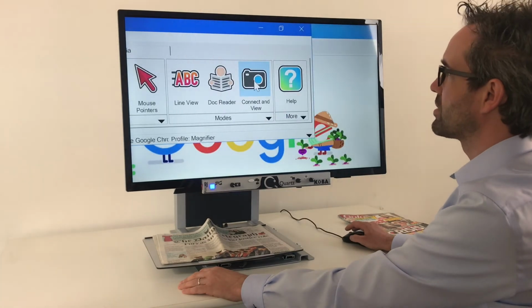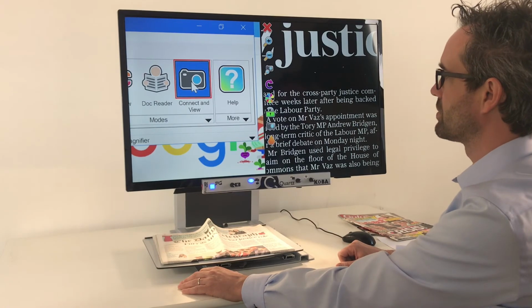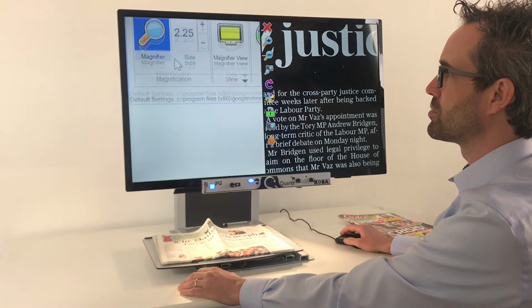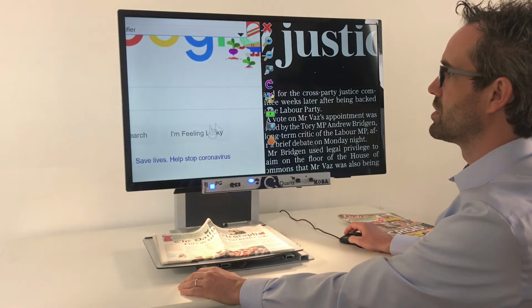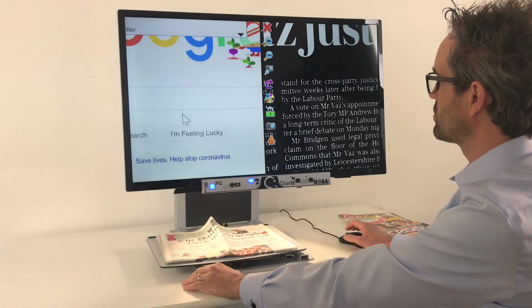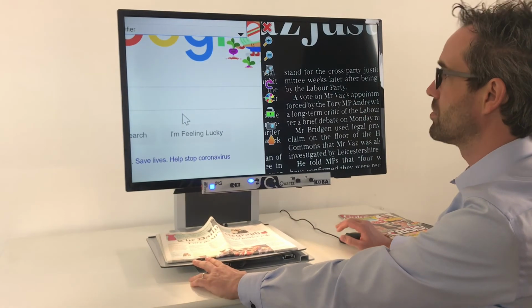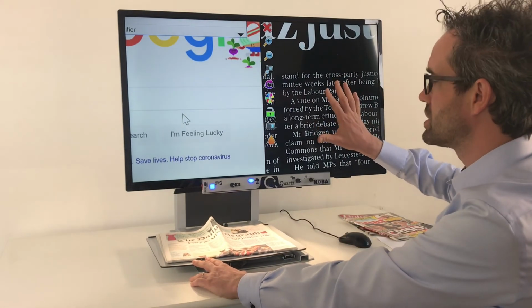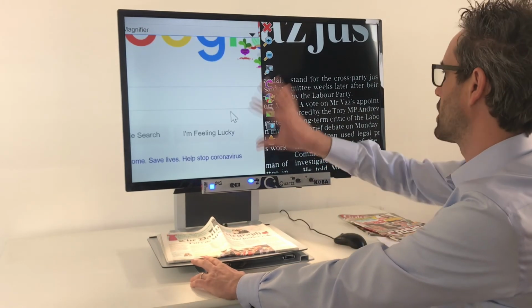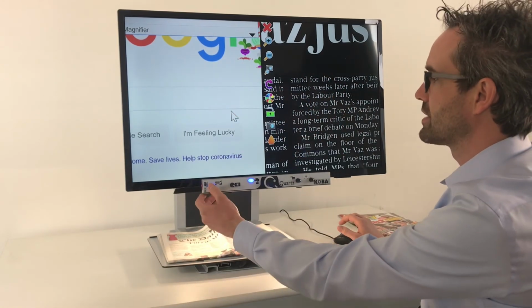You have here a camera button. If you press on that, you will have the picture of the video magnifier on the right side, and the image of the computer stays on the left side. This is interesting, for example, if you would like to pay an invoice online: you have your invoice here and you have the bank site on the left side. You also can change the position, so magnifier left or up and down, things like that.